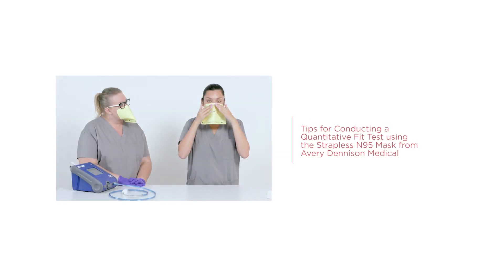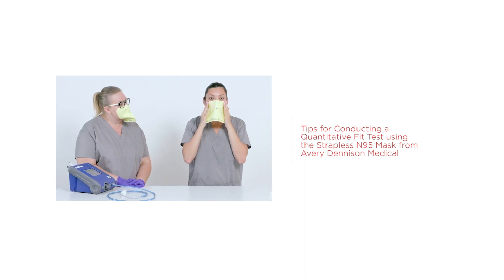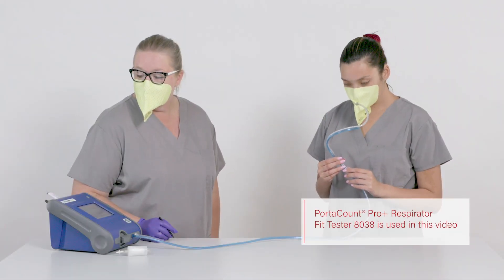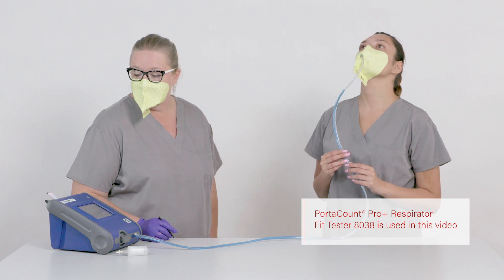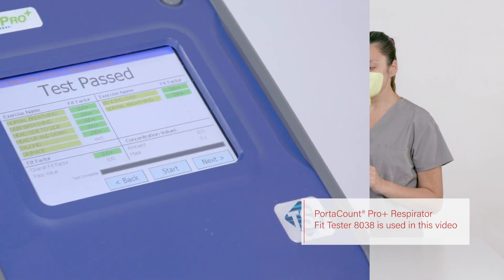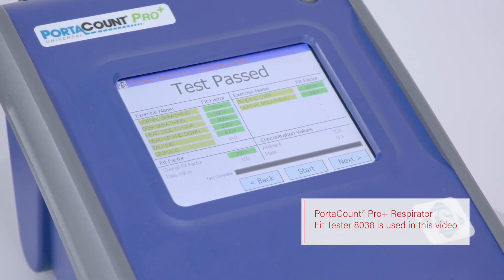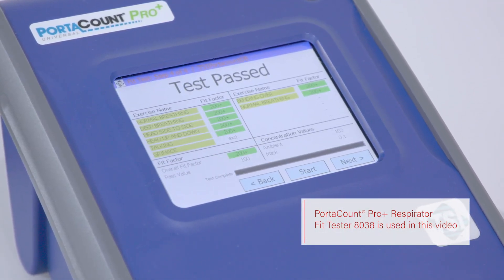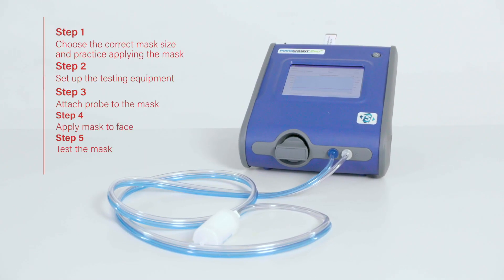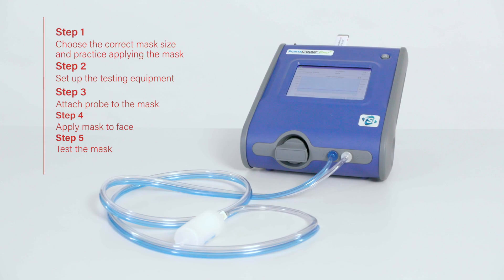This video provides tips and instruction for successfully conducting a quantitative fit test using the Strapless N95 mask from Avery Dennison Medical. The fit test measures the proper seal of the mask on the test subject, measured by particle output emitted by the subject's breath. A passing score indicates a properly sealed mask; a failing score indicates the need to refit or select another size. A successful test can be conducted using five easy steps.